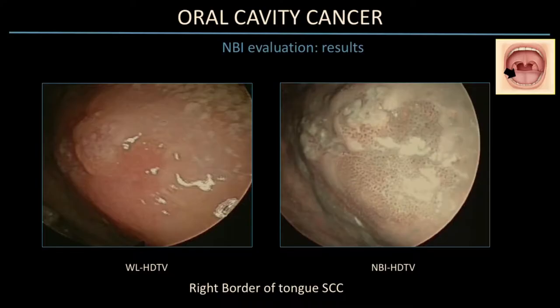Some examples show the difference between white light and NBI: the possibility to better evaluate the extension of the lesion and to recognize atypical vascular patterns inside the lesion. Importantly, the surgical margin for resection must be beyond the line between healthy tissue as defined by NBI, not just around the simple erythroplakia visible under conventional examination.